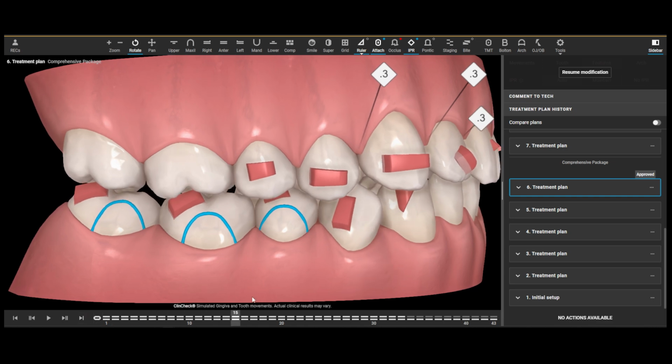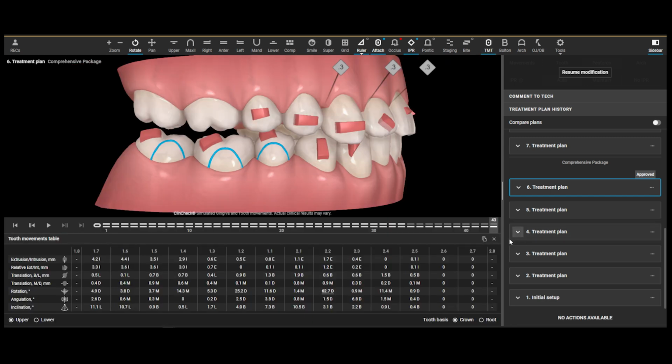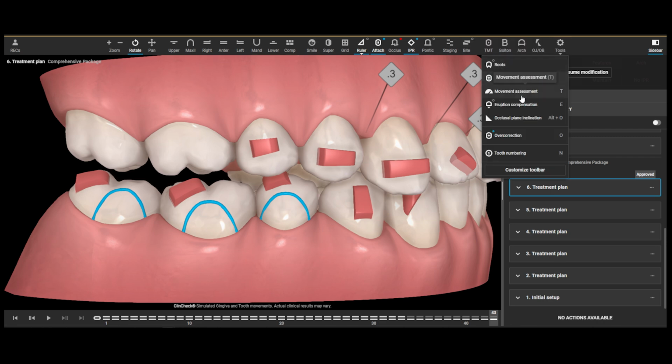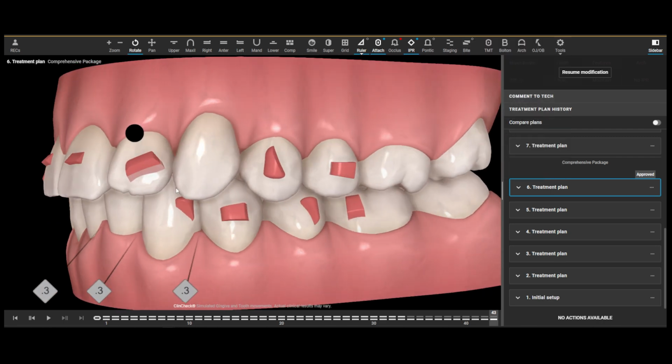In the posterior here, we're intruding these teeth, and you can see how I changed the intrusion. I overdid that intrusion. We've got a lot of intrusion on the upper and a lot of extrusion on the lower. If you were to click right now on our tooth movement assessment, check it out.